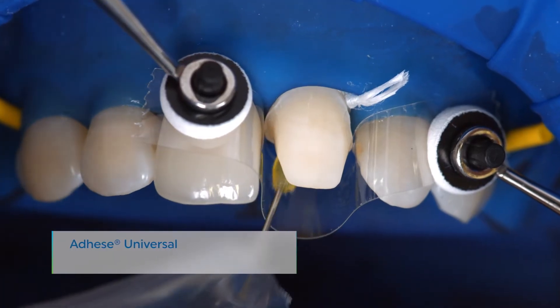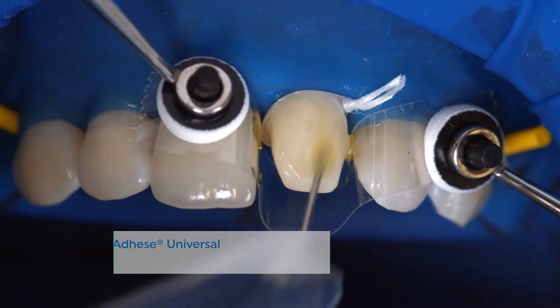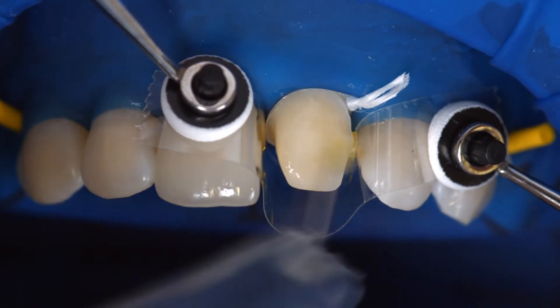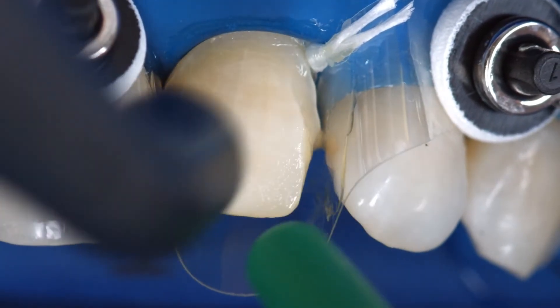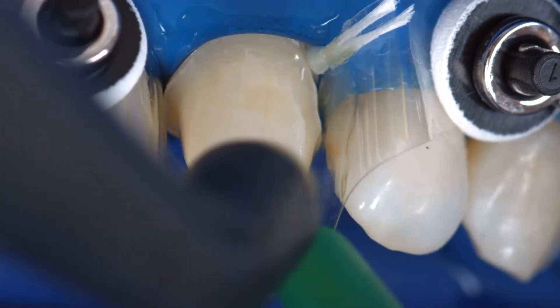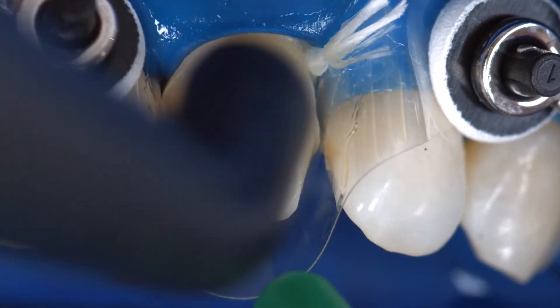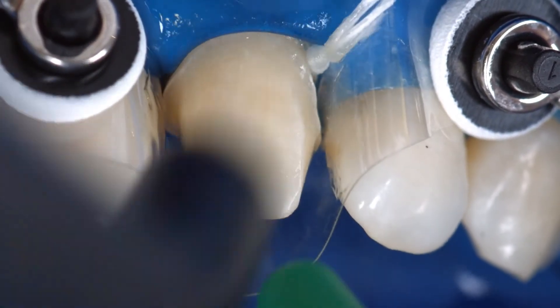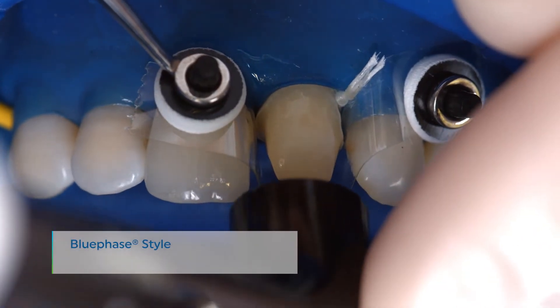Coat the entire bonding surface with Adhese Universal and scrub the adhesive in for 20 seconds. Disperse excess amounts of Adhese Universal with a stream of air until the mobile liquid film has disappeared. Make sure to avoid pooling. Light cure Adhese Universal for 10 seconds using a curing light with a light intensity of at least 500 mW per square centimeter.